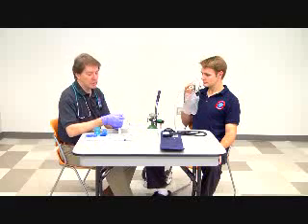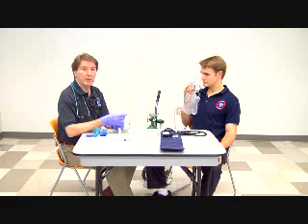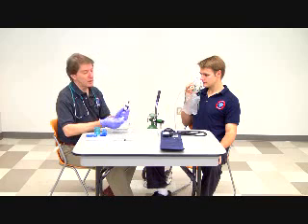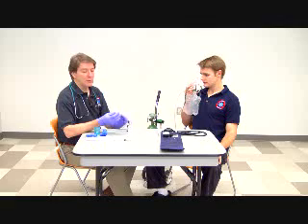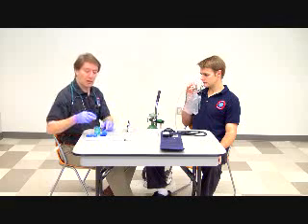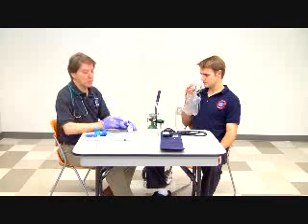You always want to assess any medication by using the 5 R's. Make sure that you have the right patient, the right medication, the right dose, the right route, the right time, and make sure in some instances that it is the right concentration. And this medication comes in 2 forms, either a concentrated version or a pre-diluted solution. If the physician has ordered a pre-diluted solution, you simply take the top off the medication, dump it into the bowl, and you're ready to administer the medication to your patient.